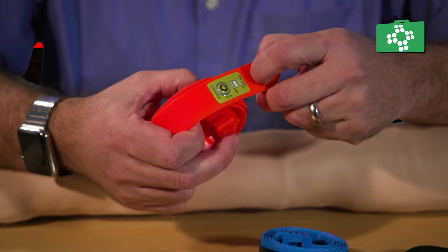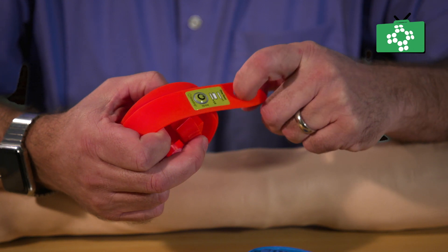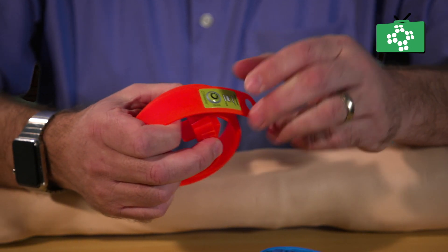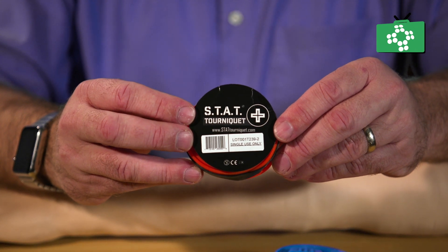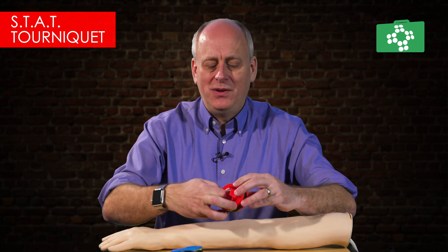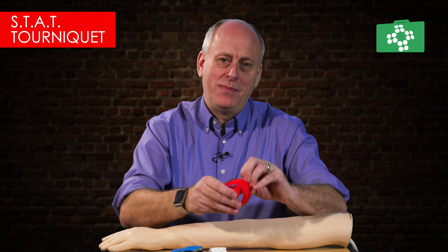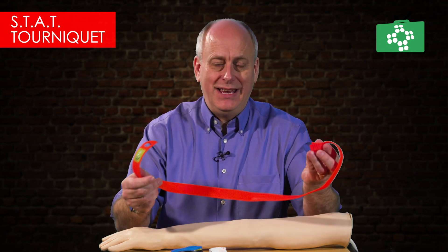There is a finger loop which makes it much easier to tighten onto the patient. These are very small and compact, easy to fit into a bag or first aid kit. You can also preload them onto a carabiner — you might have 50 of these in one area so that if you have to deal with a mass casualty incident, you've got plenty available. It's a single-use product, CE marked, and completely latex-free. When you take it out of its packaging, there's an initial label with the serial number. You pull out the instruction leaflet, unclip the rubber band, and you have the main tourniquet itself — very straightforward and easy to use.